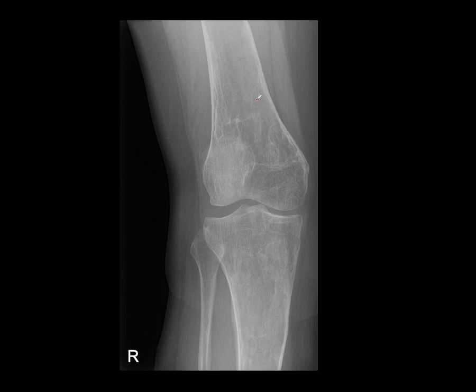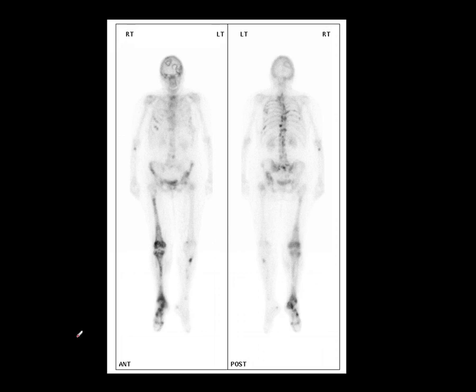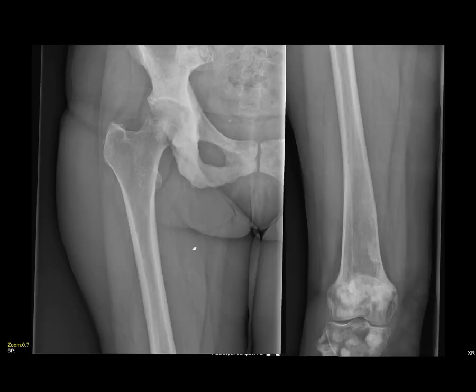The plain x-ray shows further bone textural abnormalities in the femur and tibia, with an odd modelling deformity appearance to the proximal tibia. Now, just to note — occasionally you can get metastatic disease going down a limb, as with this lady who had breast cancer and widespread metastatic disease. But she doesn't have modelling deformity; she has more typical widespread metastatic disease elsewhere. Her plain x-ray shows dense bone sclerosis, which is the sort of pattern we'd expect in metastatic disease.